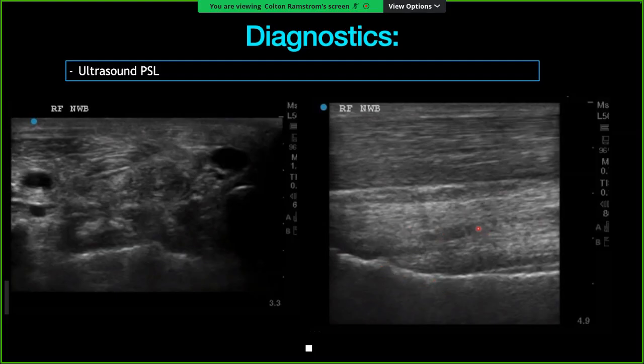Fiber pattern, the alignment of this image isn't great, so I wouldn't use that too much to try to assess linear fiber pattern. Plus, I did this one non-weight bearing, so you're going to have relaxation artifact in that anyways. This was mostly just to get a good representative view of this palmar cortex.